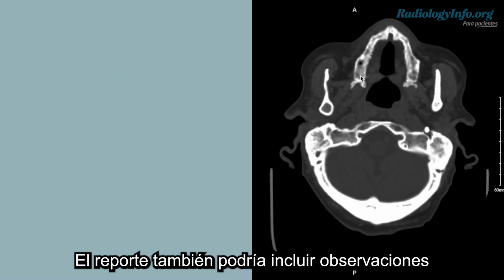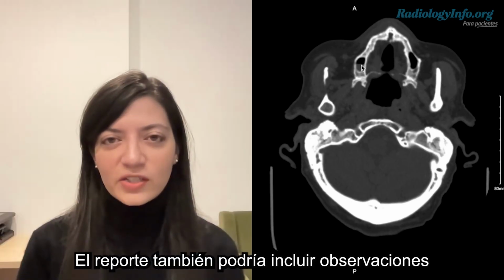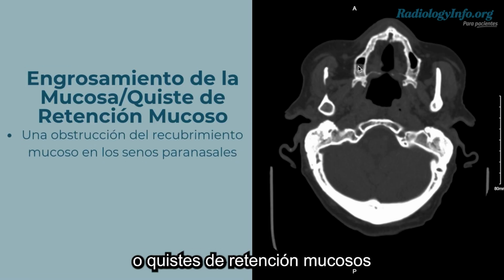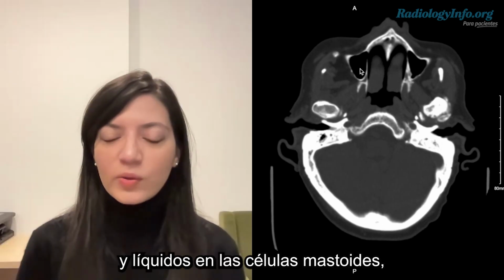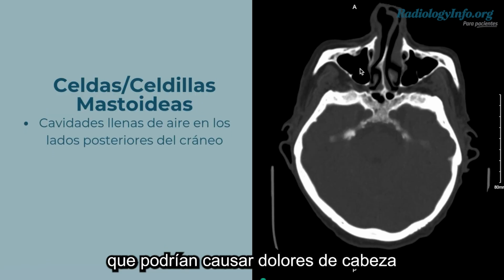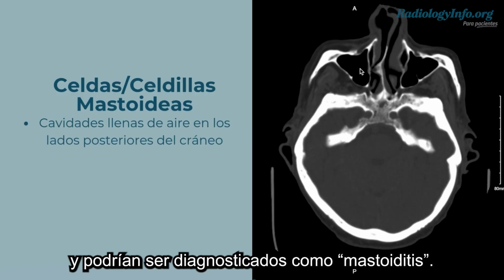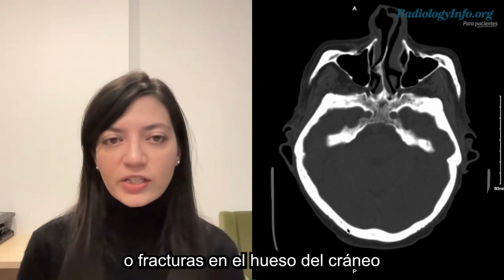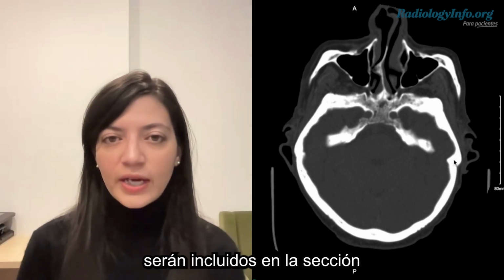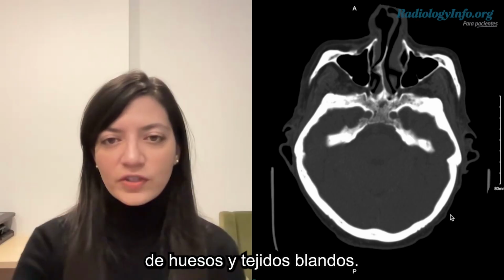The report might also include observations about mucosal thickening or mucus retention cyst in the paranasal sinuses and fluids in the mastoid air cells, which can lead to headaches and may be diagnosed as mastoiditis. Any signs of trauma or fracture to the skull bone will be noted in the bones and soft tissue section.